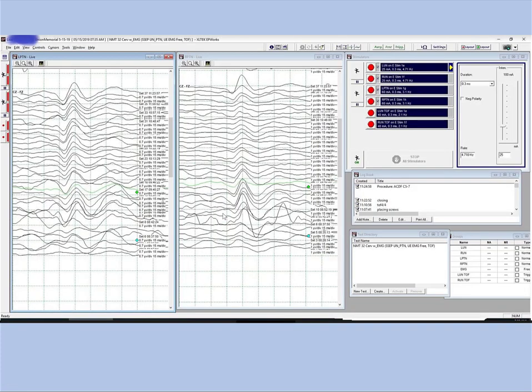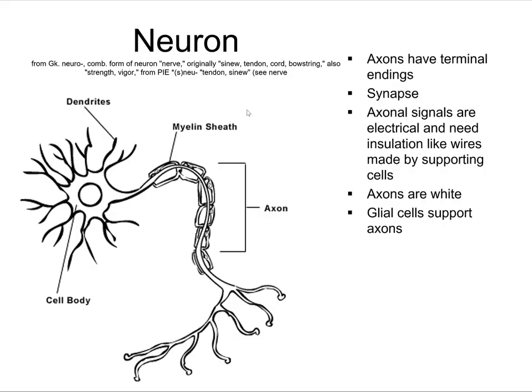So I was called back to the operating room to reposition her, and basically I just flexed the neck and we increased the blood pressure, and you can see the monitoring was flat during the beginning of the case, and then after repositioning the monitoring became normal with a normal peak and valley. So I just want to go over neuromonitoring.